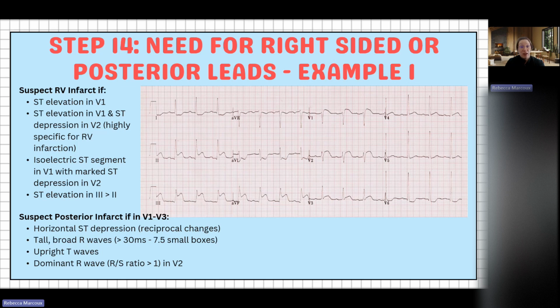So Nina, yes. You can see ST elevation in lead 2, lead 3, and AVF, which tells us this person is having an inferior MI. There's also ST elevation, good catch, Rachel, in V1, which can be a sign, again, to check for an RV infarct.